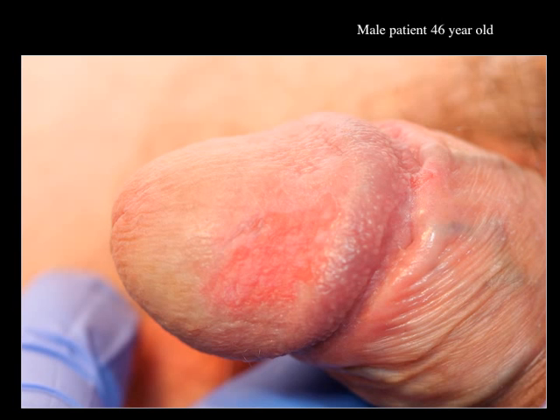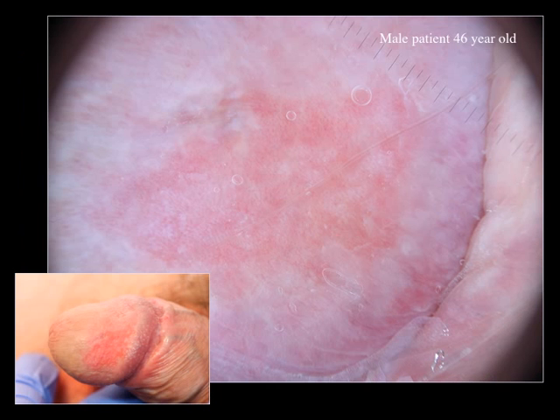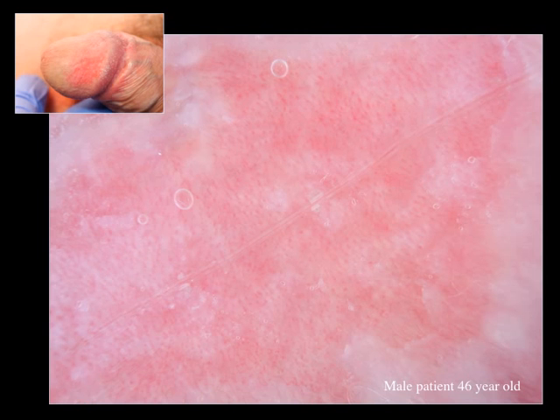Case number three: a 46-year-old male patient who noticed red spots on the glans penis a few months ago. It is not painful, slightly itchy, not bleeding, and very slowly growing over time. Here is the dermoscopy and a close-up of the dermoscopy image.